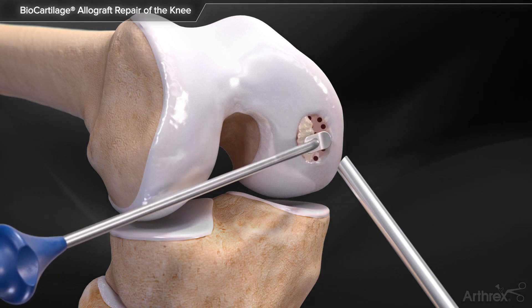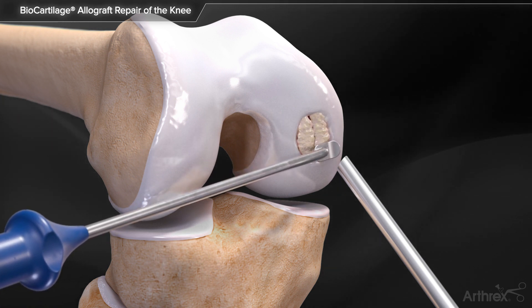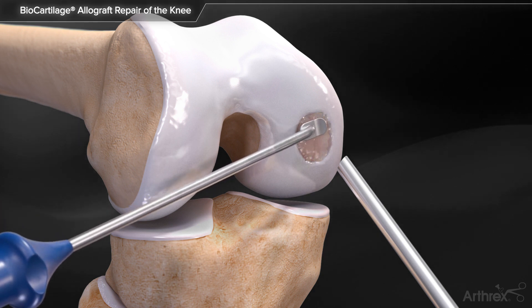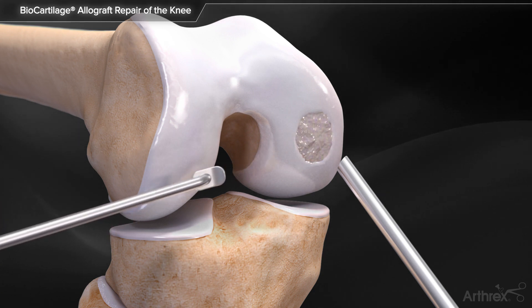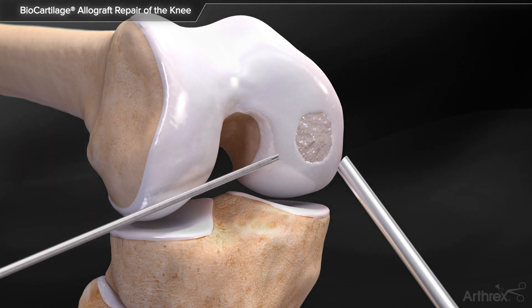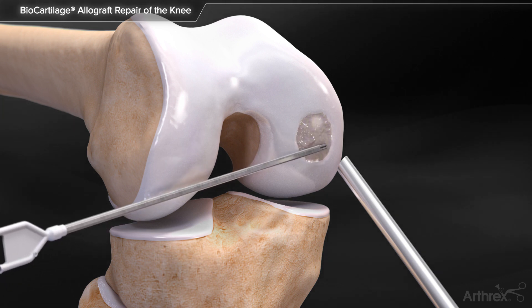The arthropaddle delivery device can then be used to deliver and smooth the Biocartilage extracellular matrix into the articular cartilage defect, leaving the mixture slightly recessed to the surrounding cartilage. Apply a thin layer of fibrin over the construct and allow it to sit for five minutes before manipulating the joint.